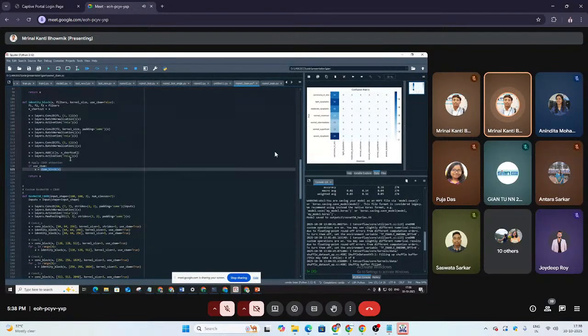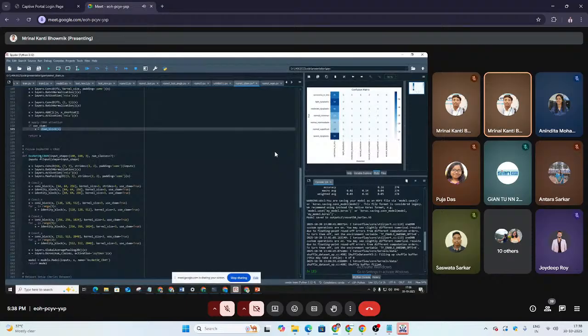The part where the convolution is added, in that part I have shown you that in the convolution block we have to do one by one convolution. At that part we can also apply the CBAM block for matching the input size and the output size. And here is the overall network of the ResNet.